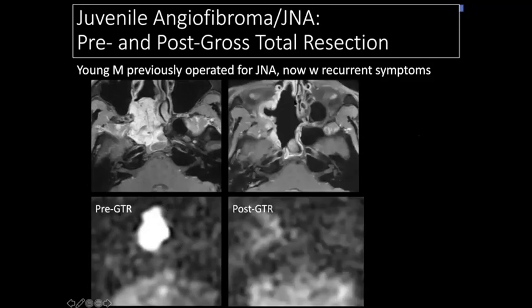When we look at our post-op imaging, we see what looks like an excellent resection, but some of these areas, it's a little hard to be sure if this is post-operative change or residual tumor, and it is highly reassuring to look at our ASL to see that there are no areas of hyperperfusion and to be able to feel confident that indeed this is an excellent gross total resection and this patient can just undergo routine imaging follow-up.